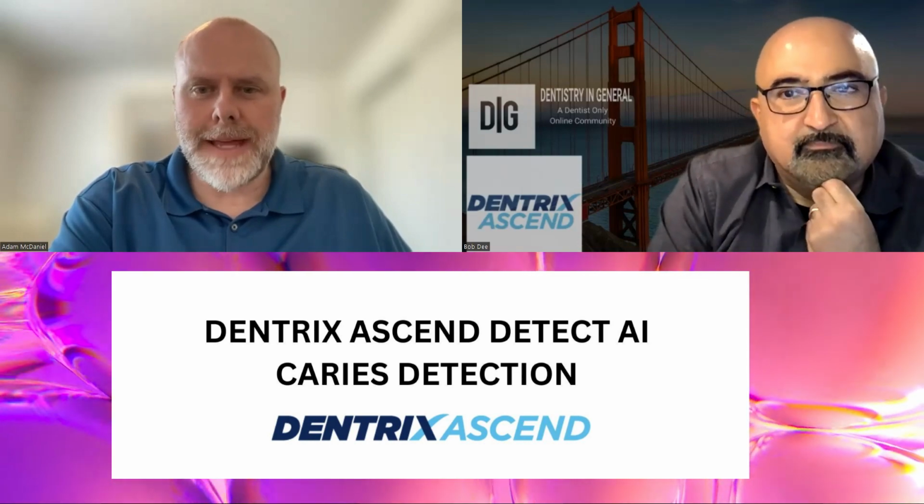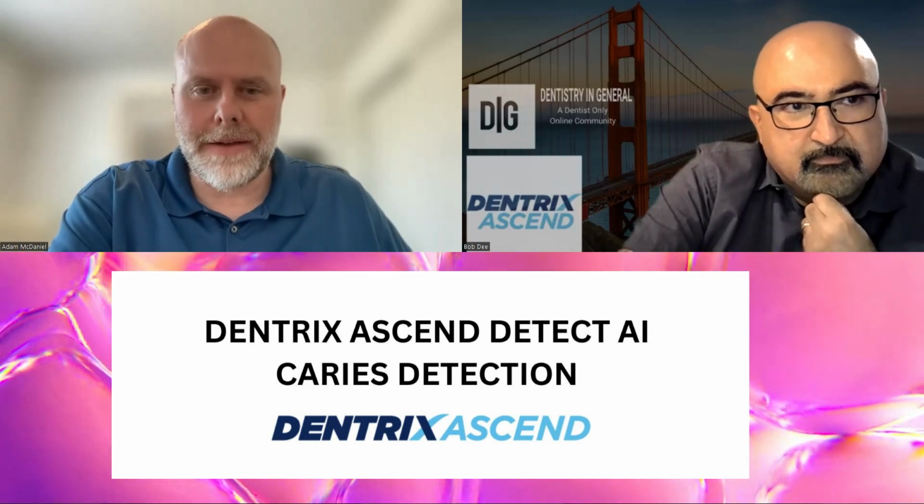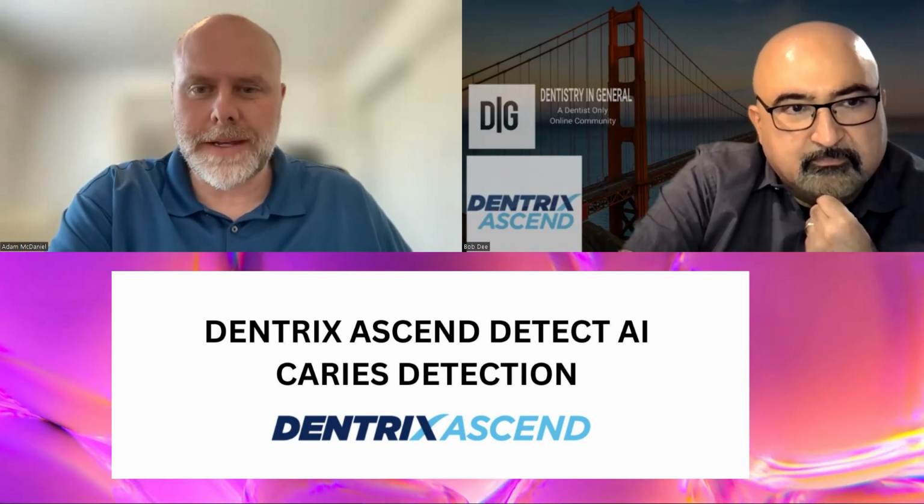Yeah, absolutely. Thanks for allowing us to be with you today, and it's a great opportunity. My name is Adam McDaniel. I am one of our directors of product management, and I work on a fantastic product team that brings great solutions from Henry Schein One to our dental customers. Today we're talking specifically about Detect AI for Dentrix Ascend. Holly and Monica are from our marketing team and are here to add anything about the Detect AI product if we have any additional points that I need help with. So great. Let's dig in.